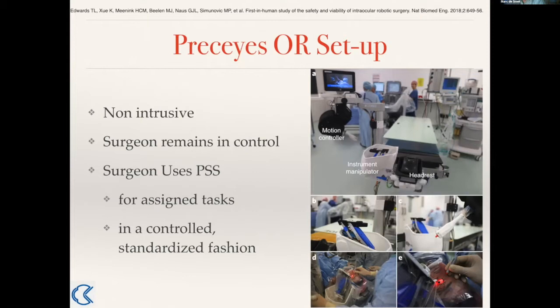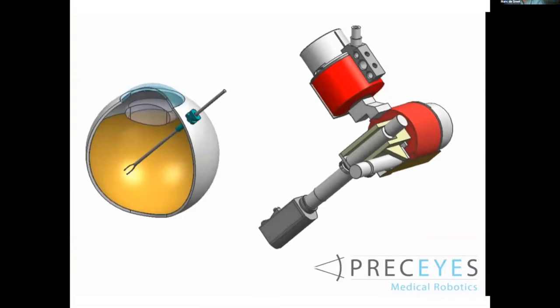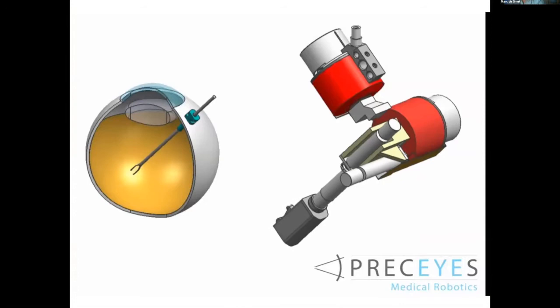So looking at vitreoretinal surgery, this is the device that we've tried to make. It's something that is called a telerobot. Whatever happens inside the eye is being directed by a manipulator on the right side. And for the first time in a surgeon's life, you're not operating at a distance, you're operating at the tip of the instrument. I think even for an anterior segment surgeon, can you imagine being able to work your phaco machine inside the eye instead of being outside? And this is the feel that you get from this.